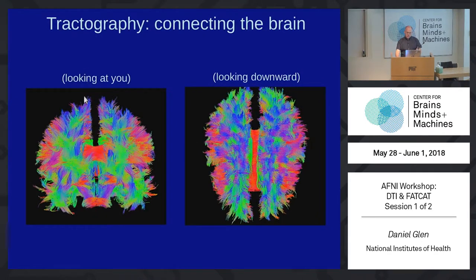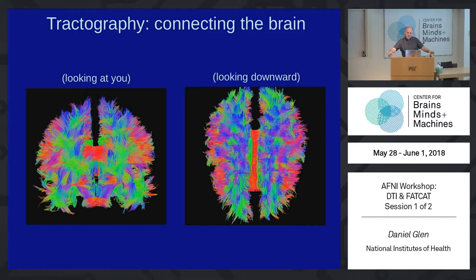In the end we can come up with this form of tractography — a view from head-on here, and looking downward over the top of the head. This method produces lots of pretty pictures and you could spend all day looking for these beautiful fibers. Groups are done at the region level generally — you take results from tables of region connectivities and compare those, not so much at the voxel level. And mostly we're going to do this in native subject space. We don't really go to standard space; we move everything into the native space, including atlases, FreeSurfer segmentation and that kind of thing.